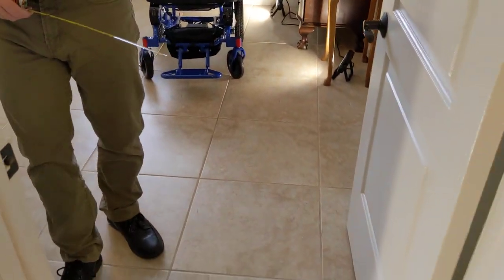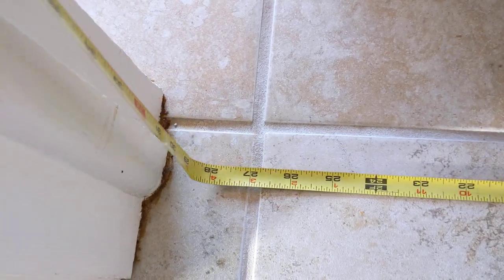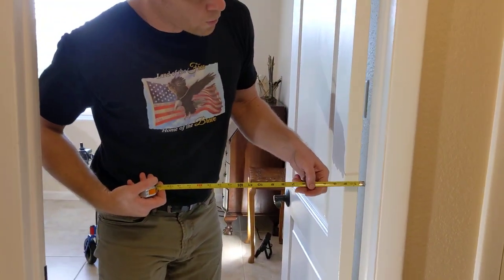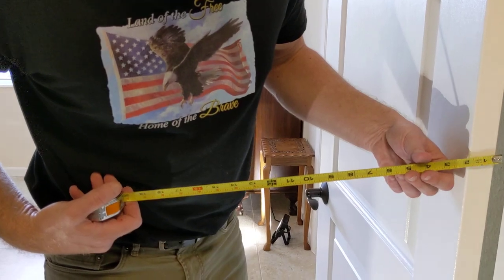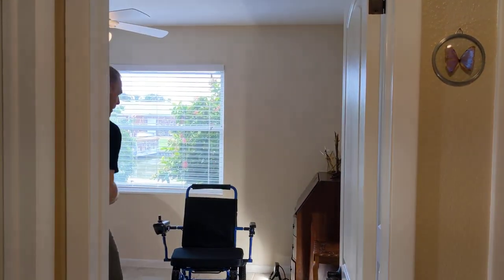So we're going to look at the first challenge that we have. Let's take a look at this door frame. If we go in between the thresholds, we've got 29 inches there. If we take a look at the door itself, we've got close to two and a half inches additional. So the big question here is: are we going to be able to make it?